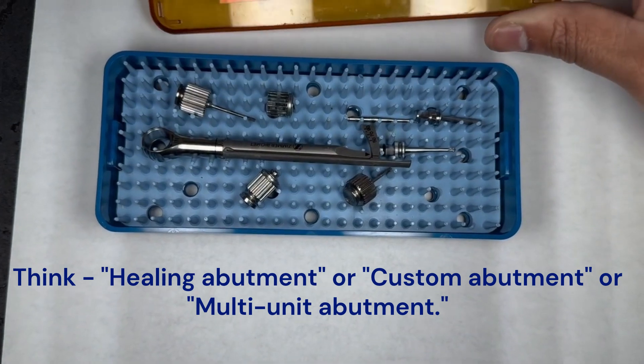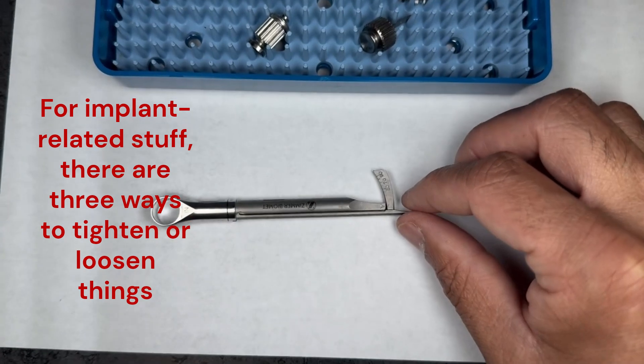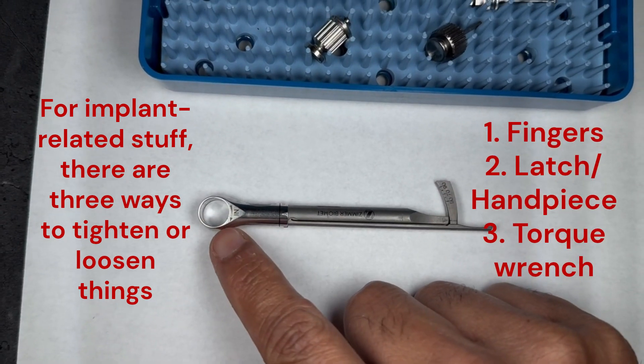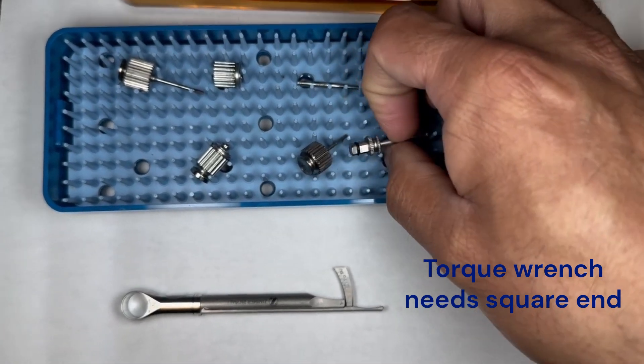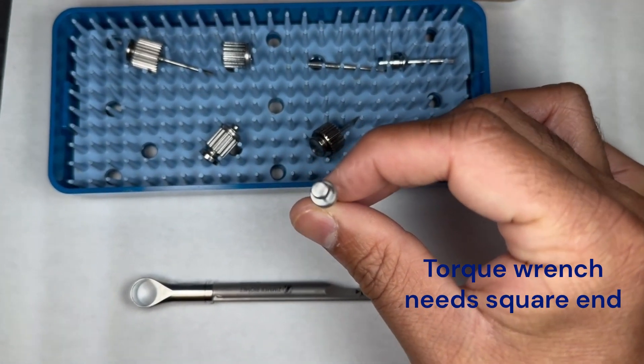The reason we do this is to perform torque tests on them. This is our actual torque wrench here. There is a piece that needs to go in here as well, and anything that requires torque wrench use is going to need one of these square end pieces to fit in there.